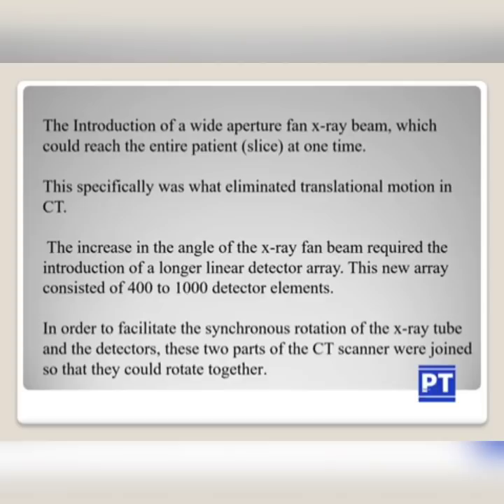The fan beam angle has increased. The increase in the angle of the X-ray fan beam requires the introduction of a longer linear detector array. This new array consists of about 400 to 1000 detector elements.